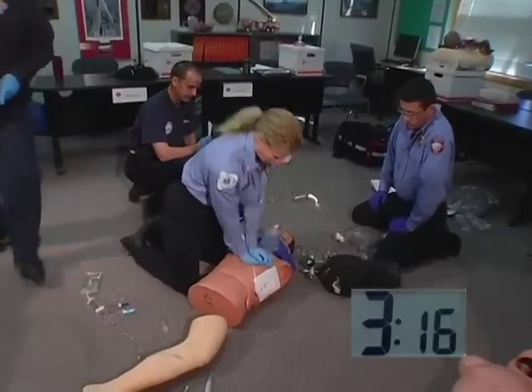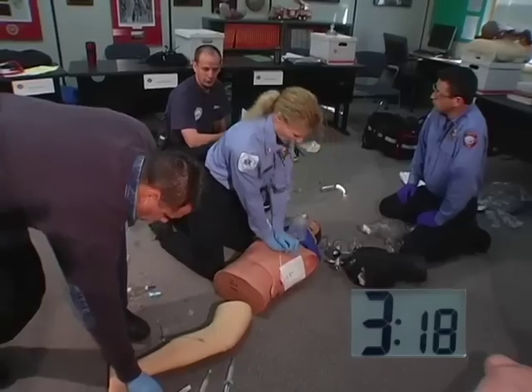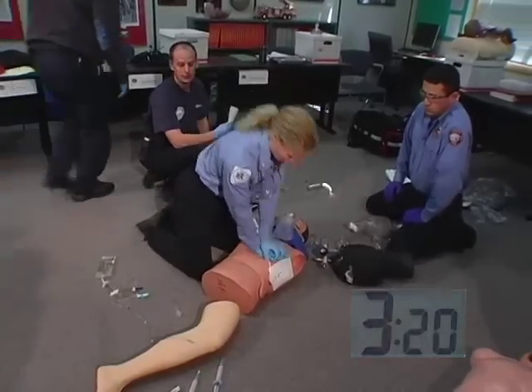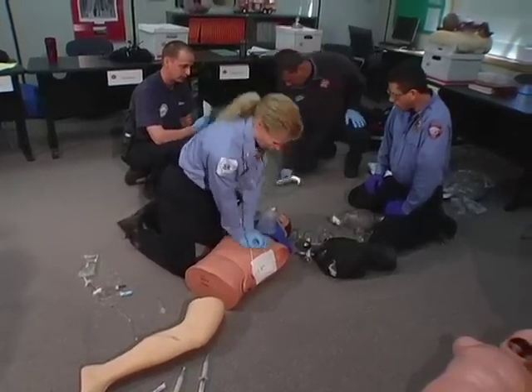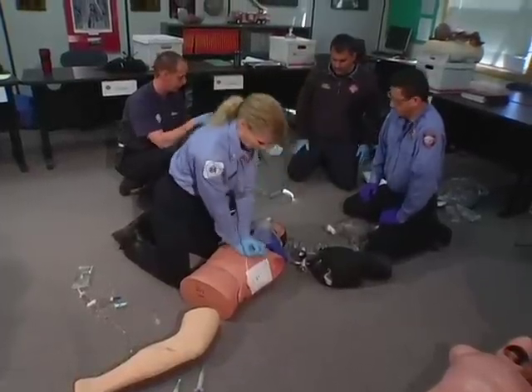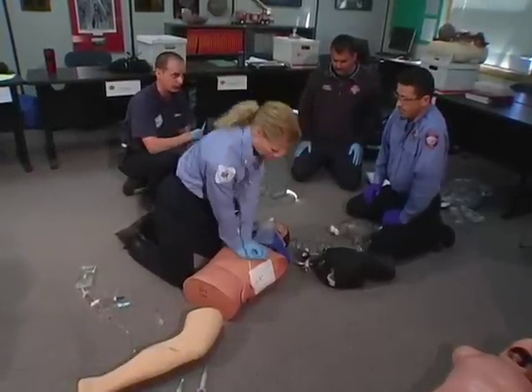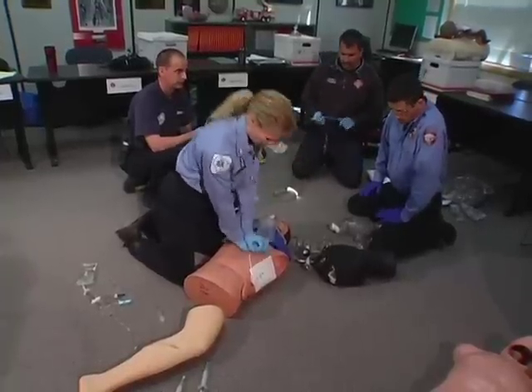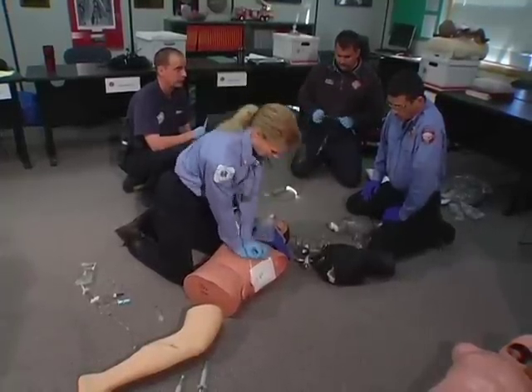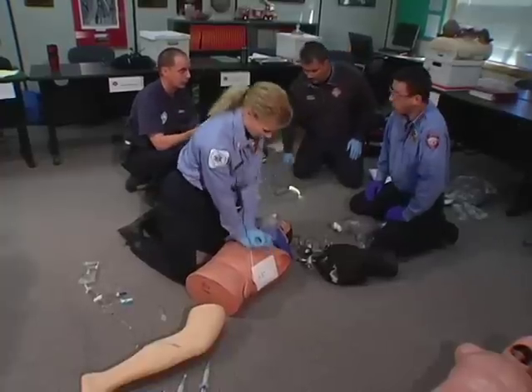Hey, code commander, what do you think? How are we doing? Everything looks good. Okay, so what's the next transition? Next transition, we're going to look for another paramedic, and then we're going to go to the third cycle for airway now. We're delayed by one cycle, so we're going to full 6 minutes. So continue with the non-rebreather and airway.